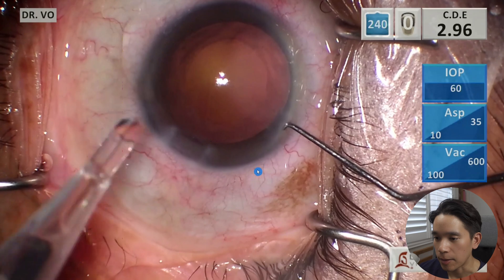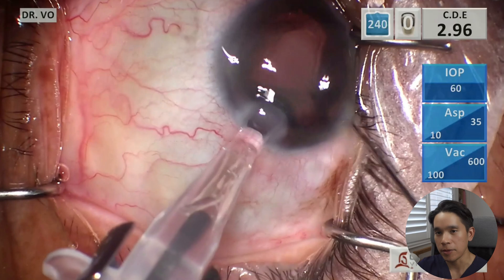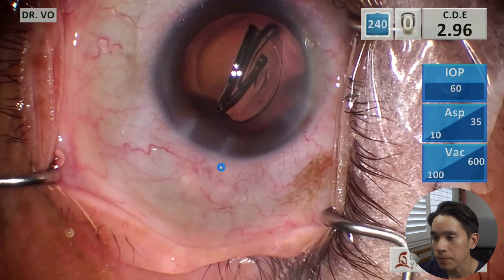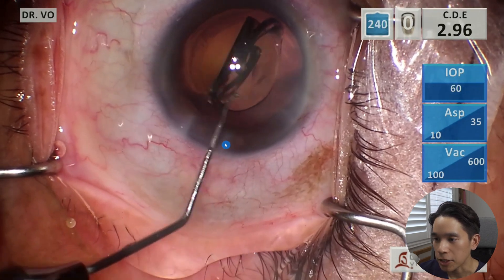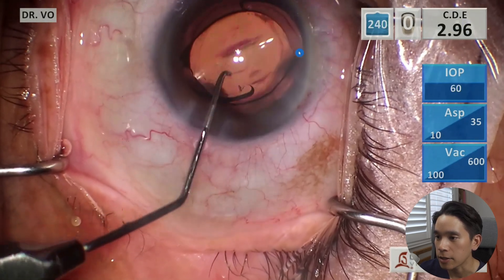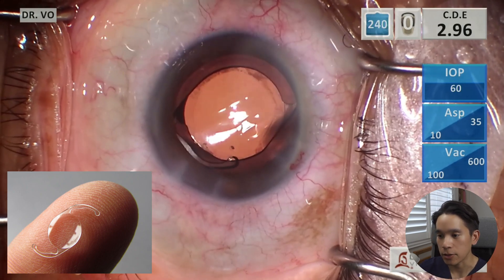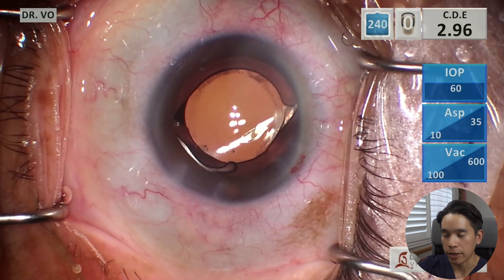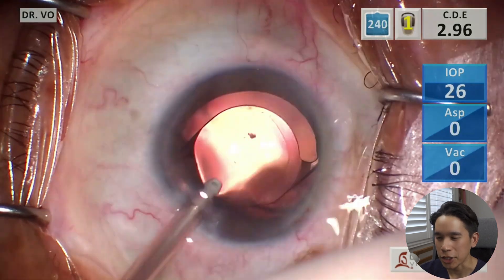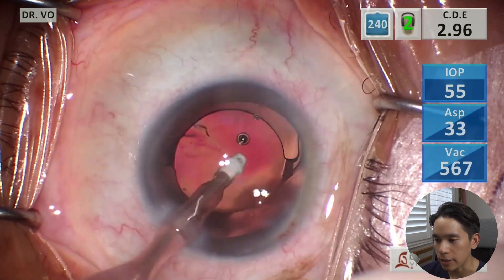The lens is going to be injected inside the eye. The lens inside the injector actually comes in kind of folded, almost like a taco — that's how it's able to fit through such a small incision. Now I'm going to position the lens inside the capsule. You can see that there are two arms on the actual lens, kind of like little hooks. As the lens unfolds and expands, those two arms will stretch out and hold the lens and secure it within the capsule. A lot of patients are always asking whether their lens will shift or move around, and the short answer is no — it's held pretty well inside the capsule.